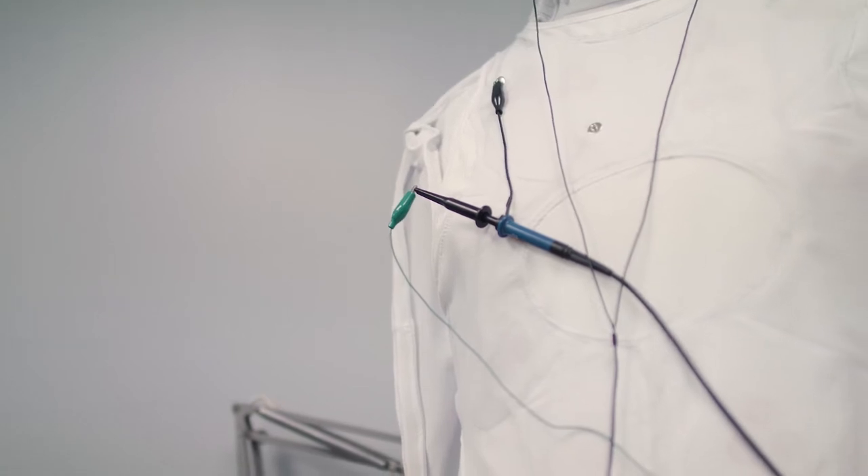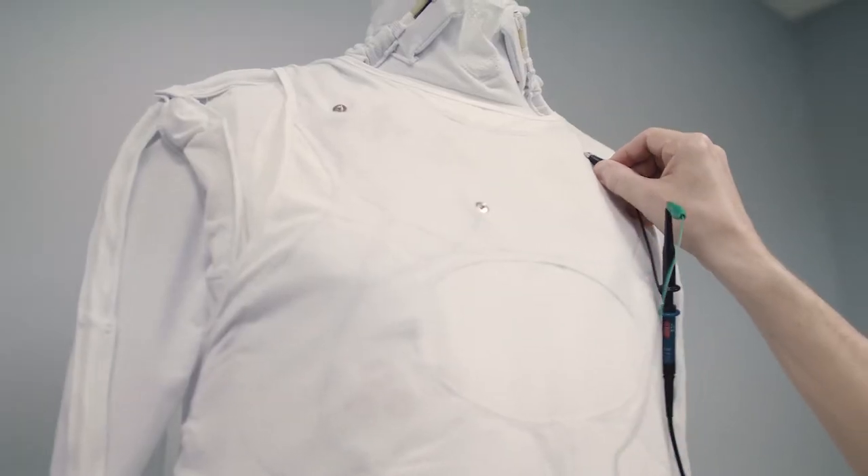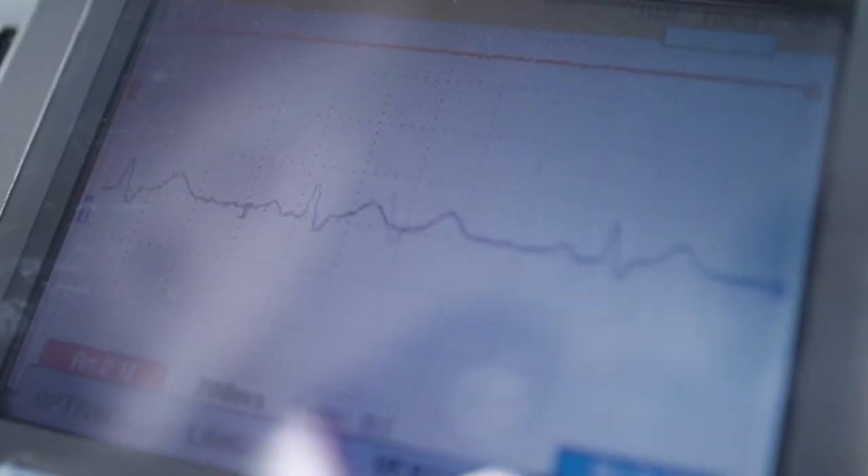The other technology in this suit is ECG posts that we embedded into the fabric, and we've run lines down to the control pack so that those signals can be controlled remotely to simulate different kinds of conditions.